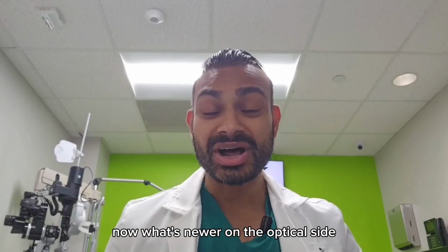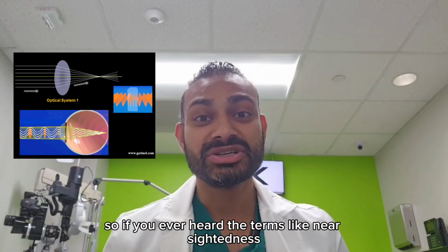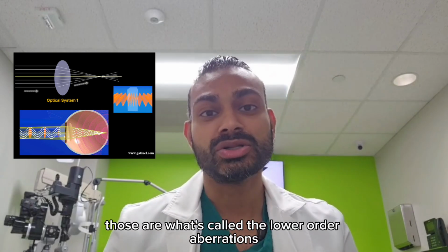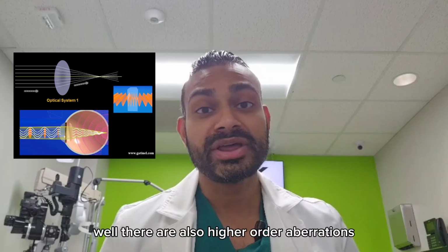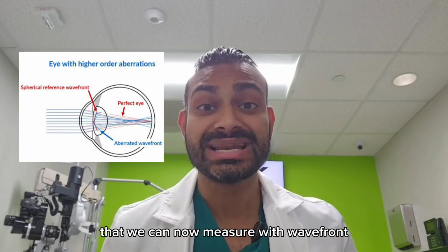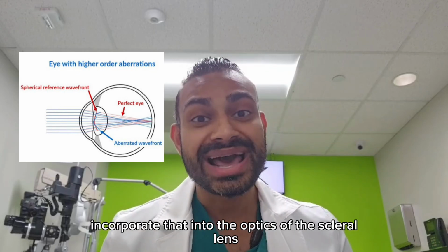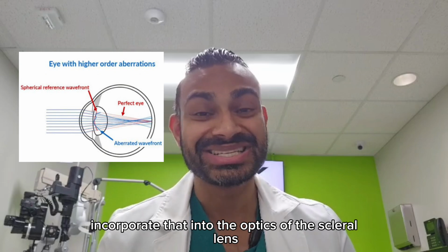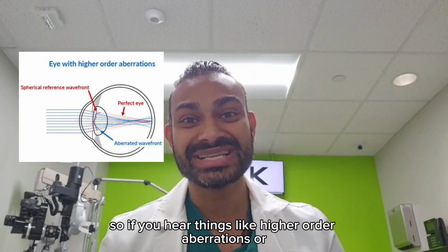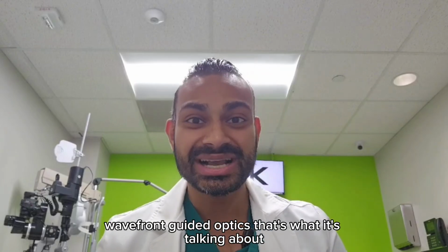Now, what's newer on the optical side is adding wavefront optics. So if you've ever heard the terms like nearsightedness, farsightedness, astigmatism, those are what's called the lower order aberrations. Well, there are also higher order aberrations, which go beyond that, that we can now measure with wavefront guided instruments and then incorporate that into the optics of the scleral lens. This is where a lot of the newest research is coming into scleral lenses. So if you hear things like higher order aberrations or wavefront guided optics, that's what it's talking about.